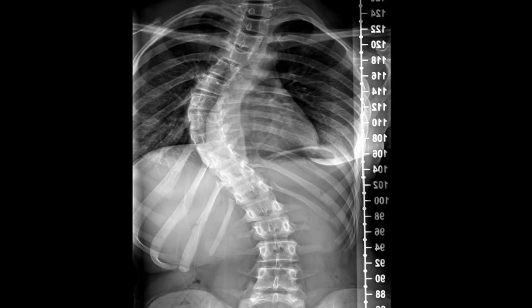With this image, the pathology that's being demonstrated is scoliosis, which is a lateral curvature of the spine. So you can see around T2, T3 that the spine starts curving and doesn't come back until around L4. In this particular image, it's being done in a PA, but it can be done PA or AP, it doesn't really matter.